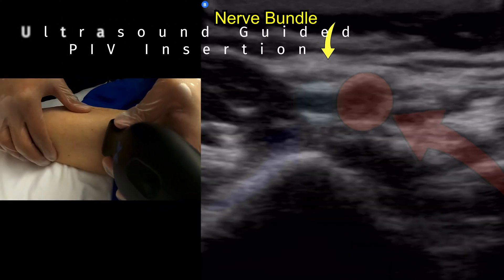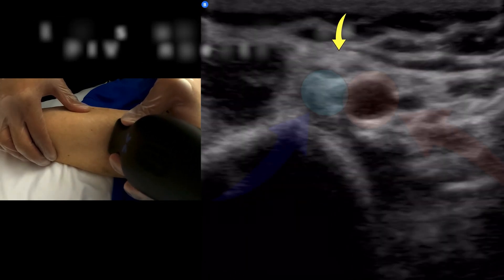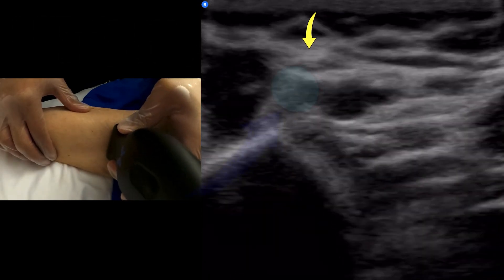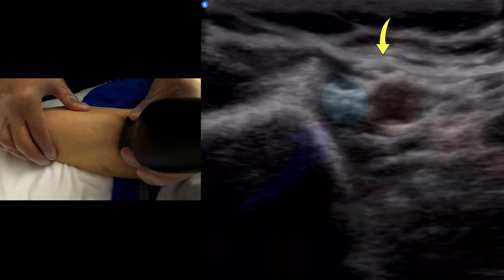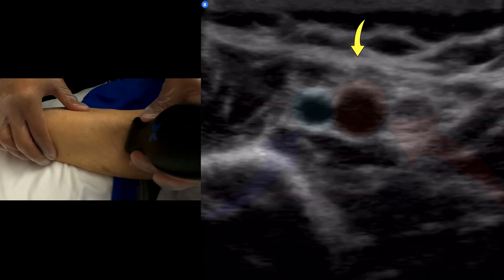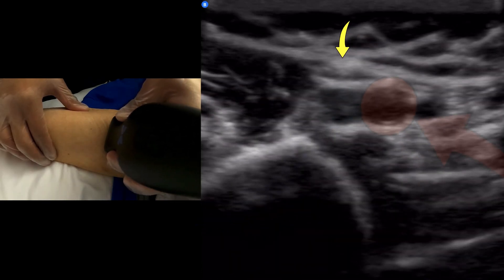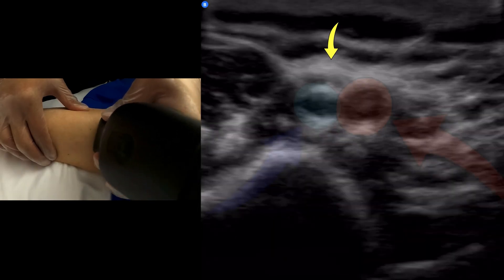Here I'm doing an ultrasound PIV. As you can see, in the red bubble there is the non-compressible circular object which is the artery, and then the easily compressible vein in the blue turquoise circle. The yellow arrow is pointing at the nerve bundle, which is a circular-ish object with a honeycomb-like appearance — non-compressible, shiftable but not compressible.